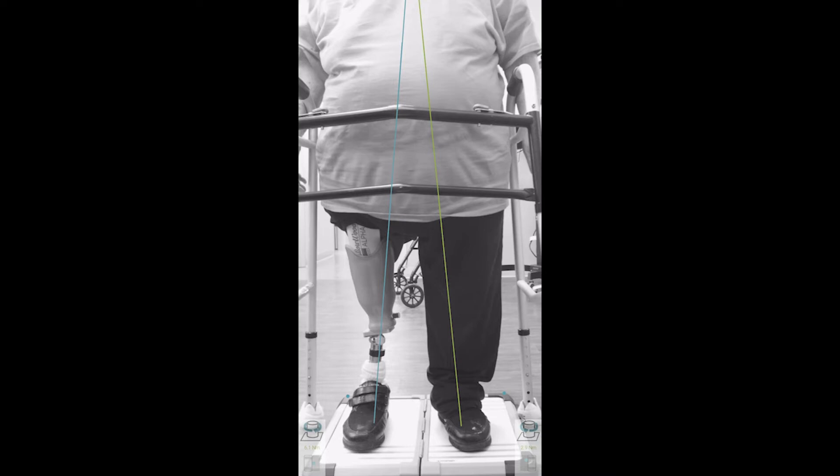Once we make our adjustments, we can compare the before and after images. This allows us to objectively note whether we have made the proper adjustment and how much more adjustment is needed.